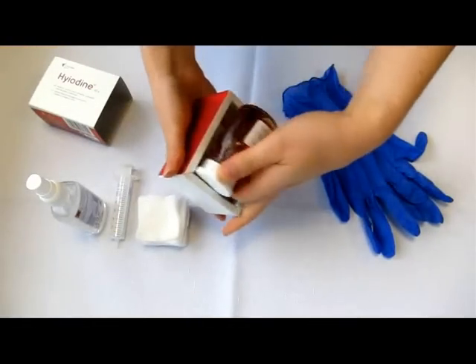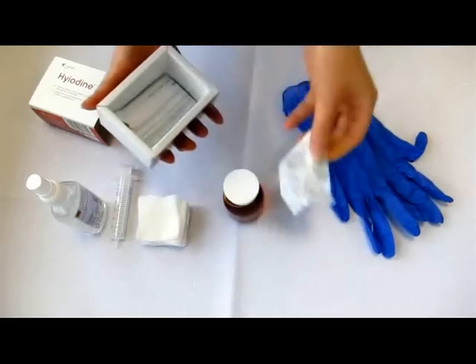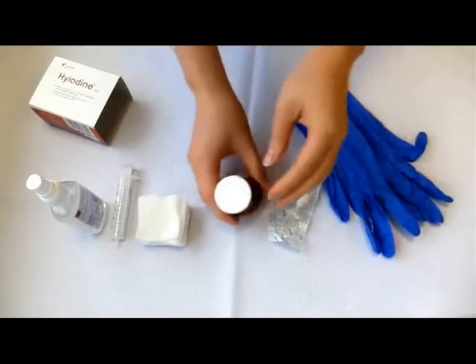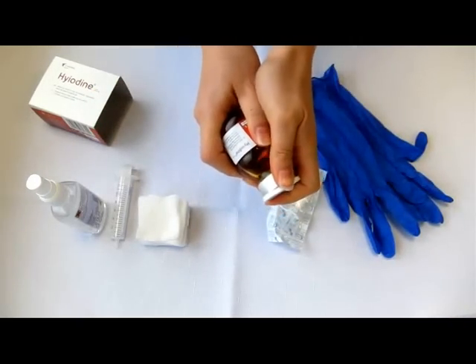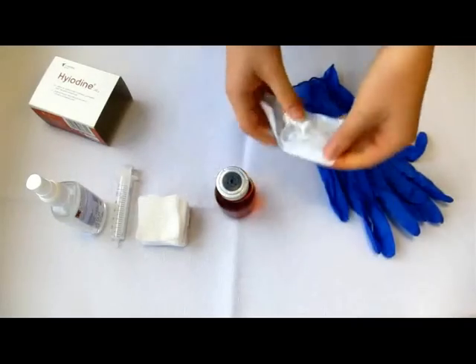Hyodyne package contains one bottle of Hyodyne and a spike. Take the white plastic lid off the bottle and remove the spike from the foil.